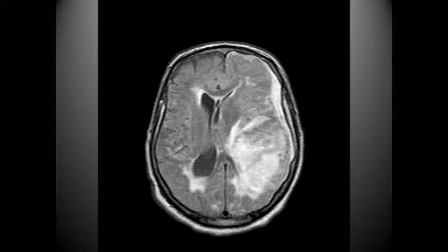Okay, on this image we have a hemorrhagic stroke. First thing to notice is here is the midline, and notice we have a shift towards the right. We have this large area here, consistent with blood, and we even have an area here as well. And so this is obviously a hemorrhagic stroke.